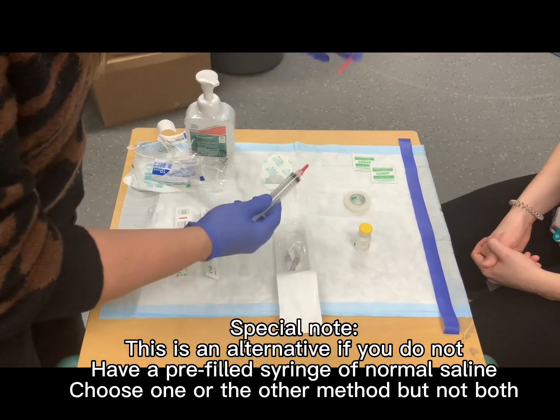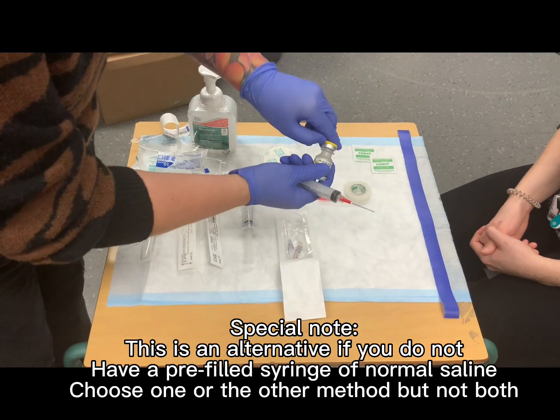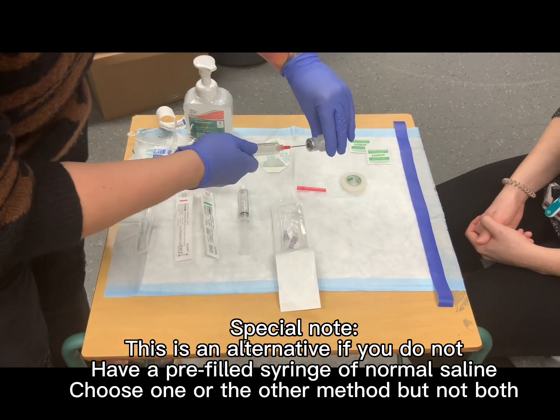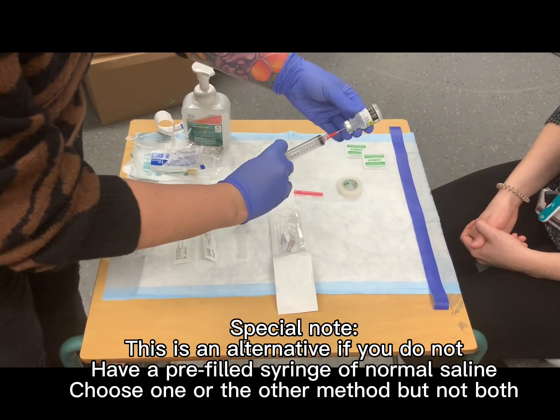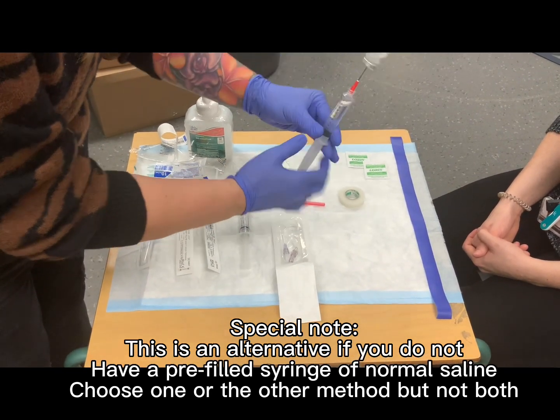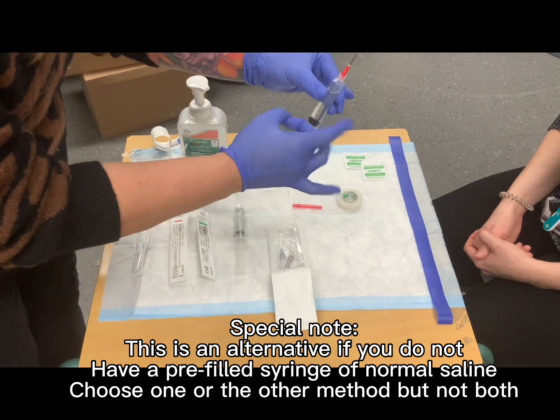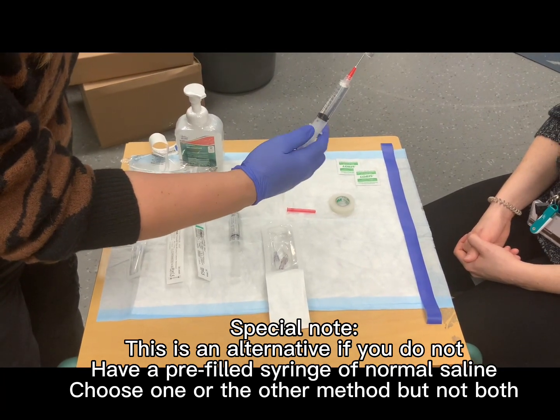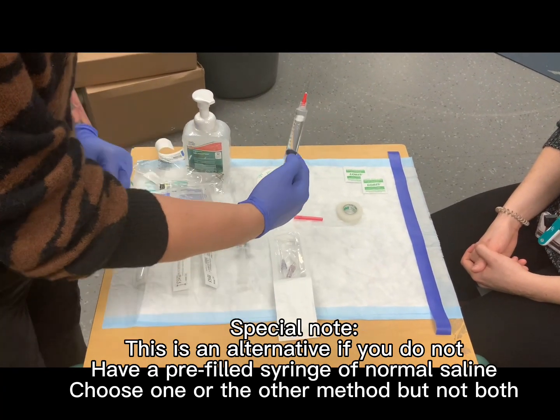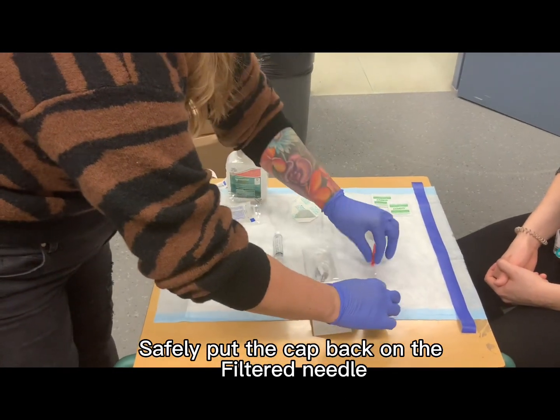Attain a 10 cc vial of normal saline. Check the expiry date. Take the cap off. Do not touch the top. Withdraw 10 cc's of air and insert your needle into the top of the vial. Withdraw the solution until you have 10 cc's of normal saline. Remove all the air bubbles from the solution and place the cap safely back on the needle.